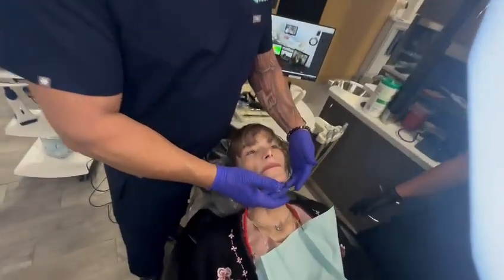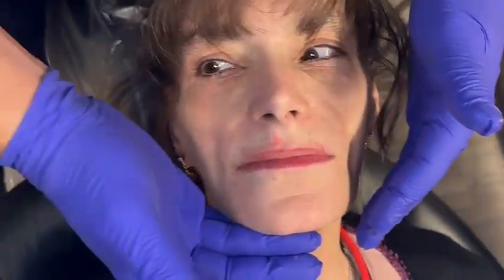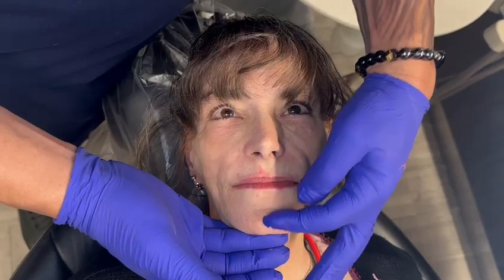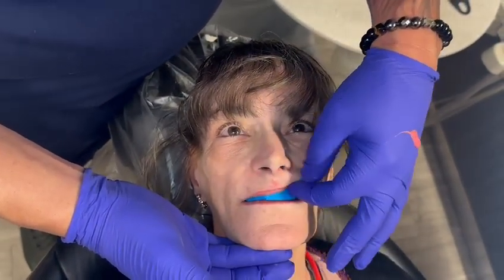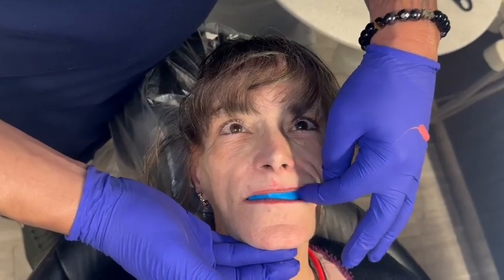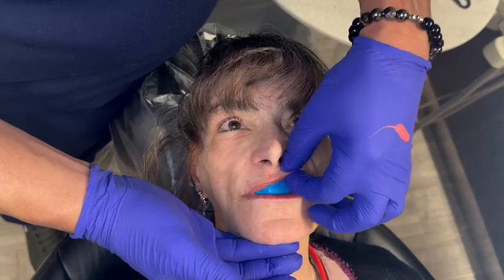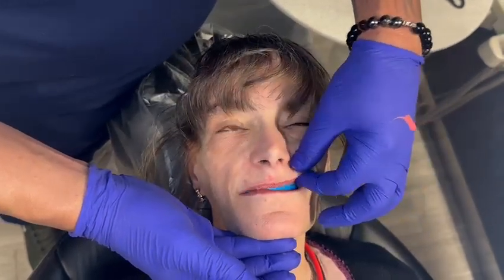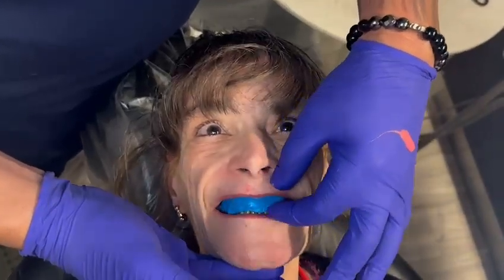Look at her whole face. Look at the proportions of her face now. Come right straight in front of her. She just looks at least 10 to 15 years younger already. Just because now we've got a nice strong chin, lower third of the face. Your lip looks fine. These are a little bulky — this is just the putty — but it's not bad. Your lip looks great, a little bulky in the corners, but this looks good.